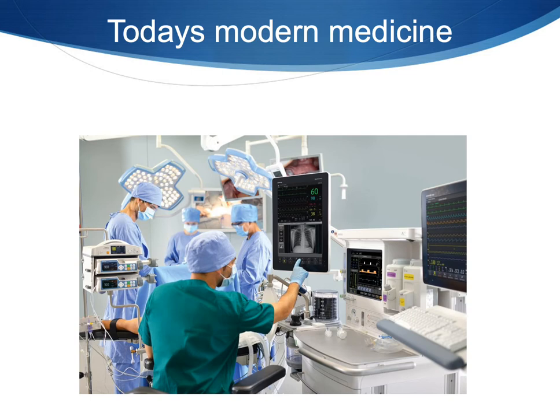Then, in the mid-1980s, monitoring standards began to become officially recognized, with much emphasis on the ever-improving electronic monitors. By 1991, capnography and pulse oximetry were firmly established. At this time, the precordial stethoscope failed to hold the interest of anyone new entering the profession.